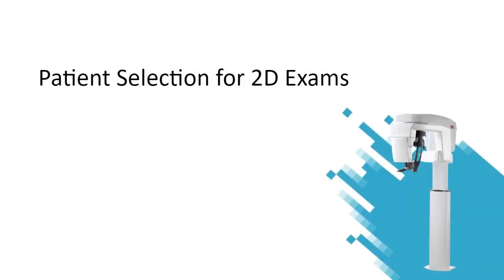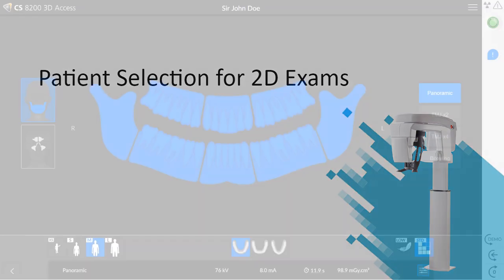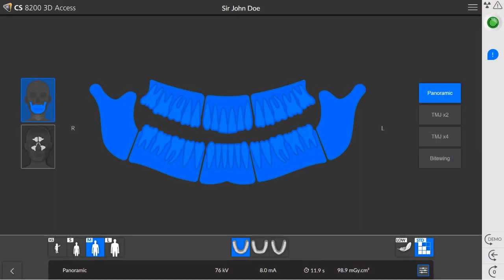Patient selection for 2D exams. In all 2D exam types, you have two settings that can be adjusted. On the main interface, select the patient's head size: child, adult small, medium, or large. When you select the appropriate head size, the KV and MA are adjusted automatically. Next, on the main interface, select the dental arch morphology or jaw shape. When you select the appropriate jaw shape, the trajectory beam is adjusted to capture the correct focal trough.